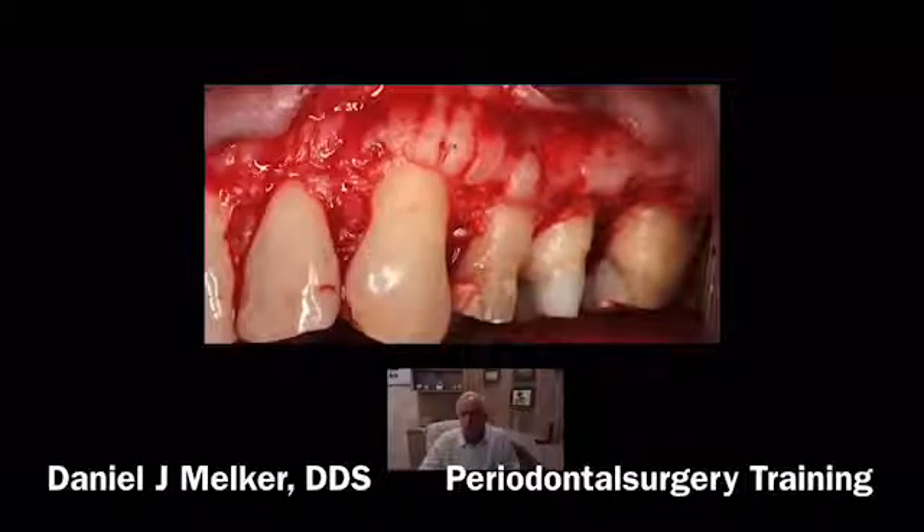This is a very irregular bone — look how thick it is here, and look how thick it is there. We want to reflect our flap back so that we can treat all the bone and not traumatize the flap. I'm going to push the flap back so I can treat the bone, but I still want to keep the periosteum maybe even 10 millimeters higher so I can suture to it.